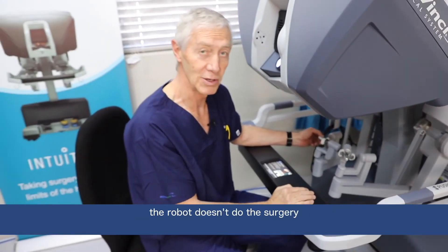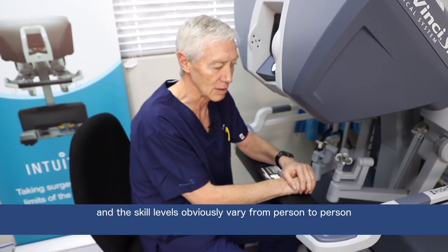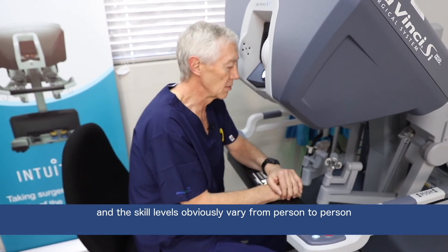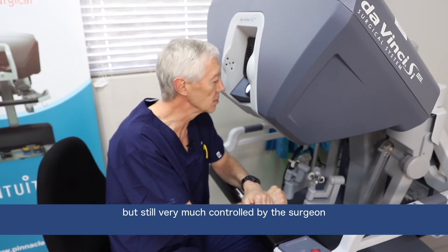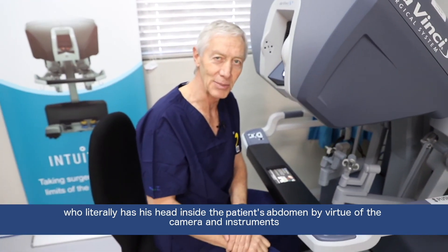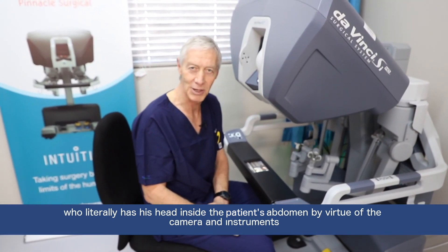The robot doesn't do the surgery — the surgeon still does the surgery. The skill levels obviously vary from person to person, but it is still very much controlled by the surgeon. He literally has his head inside the patient's abdomen by virtue of the cameras and the camera instruments placed in the patient.